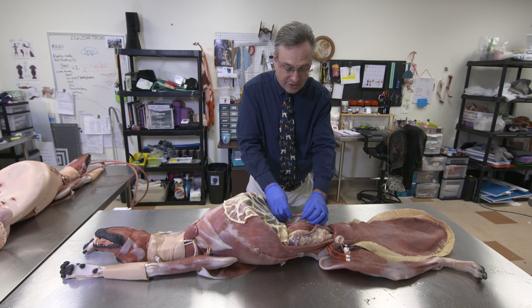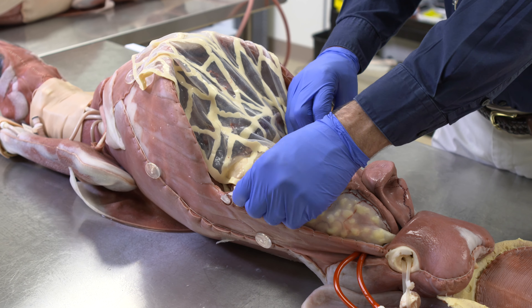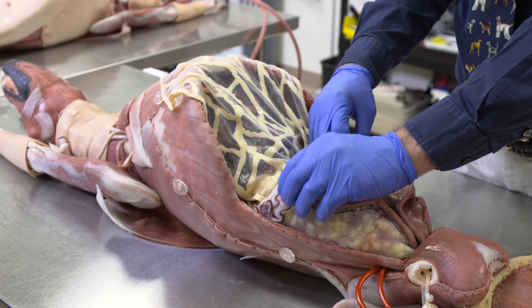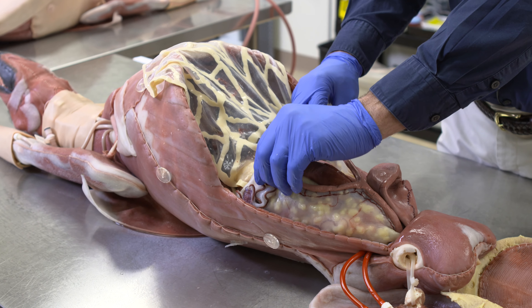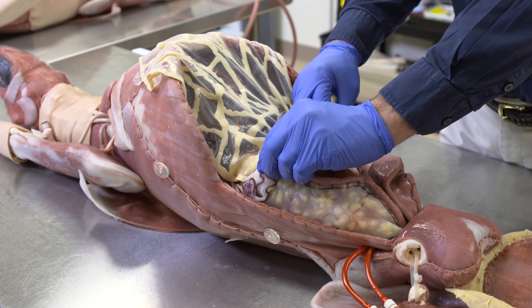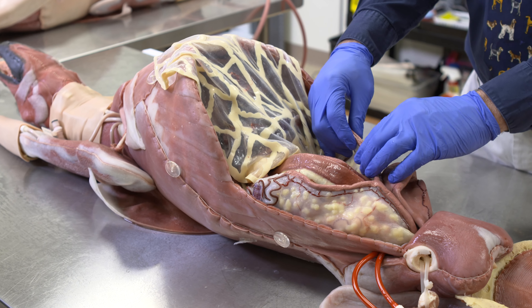This is a female dog — it's also designed as a spay trainer. We do have the reproductive tract represented. It also has the suspensory ligaments, the broad ligament, the horns, and the ovary. You would have to approach the abdomen, go in and break down that suspensory ligament, ligate the ovarian vasculature, and then come down, break it down, and remove this as you would a common spay.